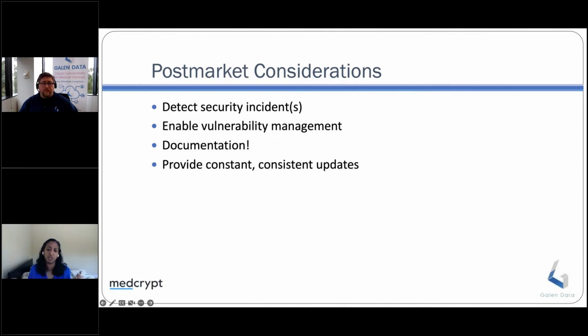I think if you take a typical scenario, a device goes down, hospital IT gets called, they try to fix it, they flash the firmware, reset the thing, send it back out, and hopefully it works for a little bit longer. When the device maker finally knows something went wrong is often well after the event. There's no logs left because it's all been wiped. And there's no intentionality around seeing if it was a security event. They're looking for operational data, perhaps rightfully so, but it really disenables a device maker from figuring out if one of their security designs was problematic and how this thing was going to operate in the long term.